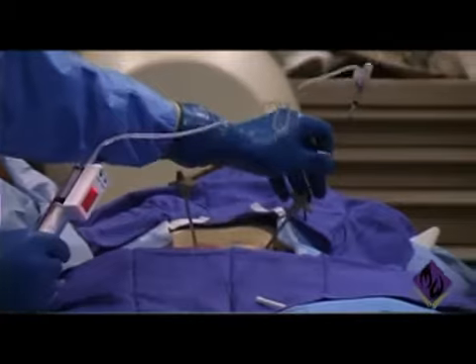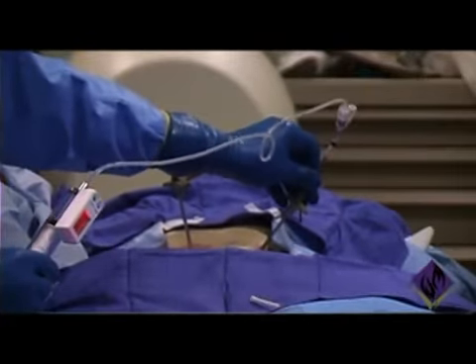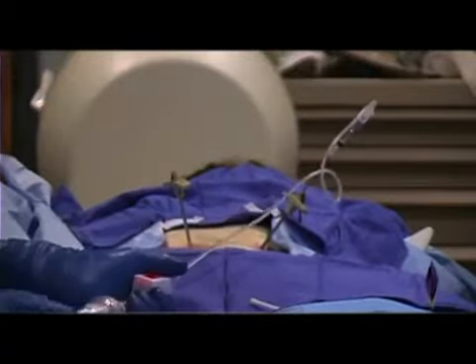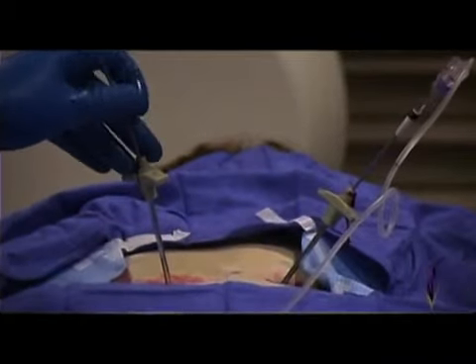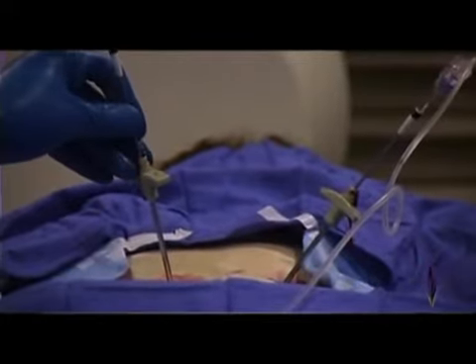Balloons being placed now through the cannula. You can see those two metallic dots which are identifying where the balloon is placed. And start inflating it now. The other one is now going in on the other side. Inflate. This balloon's harder to see because it's partially obscured by the balloon on the other side. You can see it now filling along its superior and posterior margin. It's now coming close to the superior end plate.